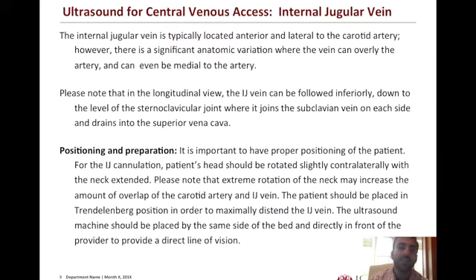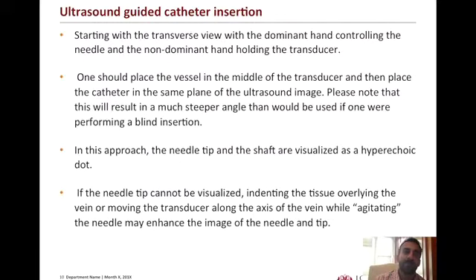It is a very routine technique. I won't go through all the verbiage here on this slide. But again, the key topic when it comes to the use of ultrasound for internal jugular venous cannulation is the ability to identify the carotid and know the actual path of the internal jugular vein, therefore decreasing potential needle puncture attempts. This is one approach of how you can use ultrasound to facilitate the procedure itself, and I will allow you, as this is also an iBook, to read through this.